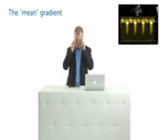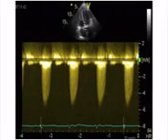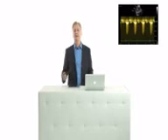What we just got was the maximal gradient. But there's another gradient you need to know, the so-called mean gradient. To get that, you take the curve and you simply trace it. Okay, so you would trace the curve here and thereby get what we call a mean velocity. And then you just take this mean velocity, just as you did the maximum velocity, plug it into the formula, and you will end up with the so-called mean gradient.